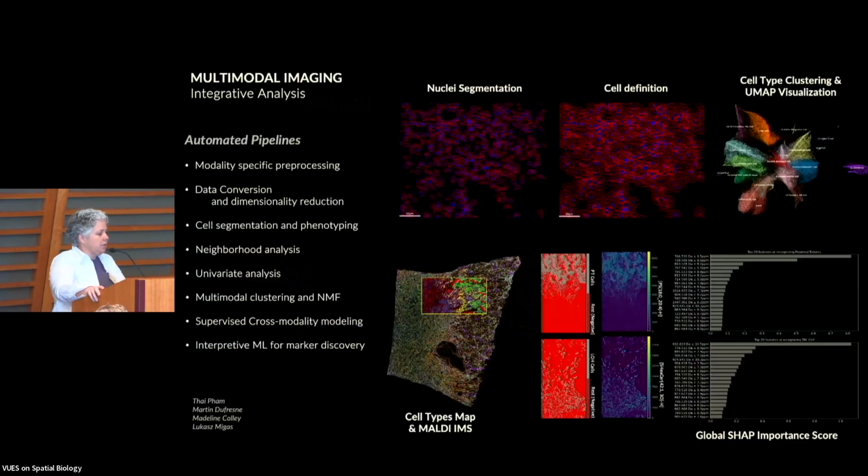And this allows us to do some really unique analyses, because now not only can we do segmentation and definition of the cells, but we can actually generate neighborhoods. And we can take those neighborhood masks, similar to what we did with the autofluorescence FTU segmentation mask. We can use those neighborhood masks to now mine the molecular data that's associated with those neighborhoods. And this is actually generating some really interesting observations that Ty is putting together in a manuscript that's going to be submitted in the near future.